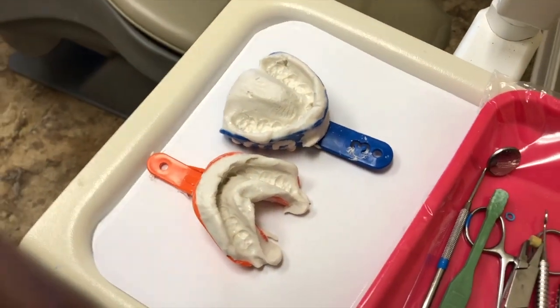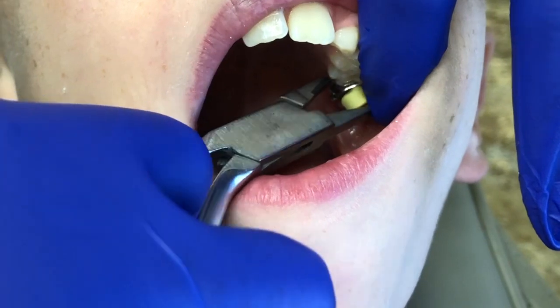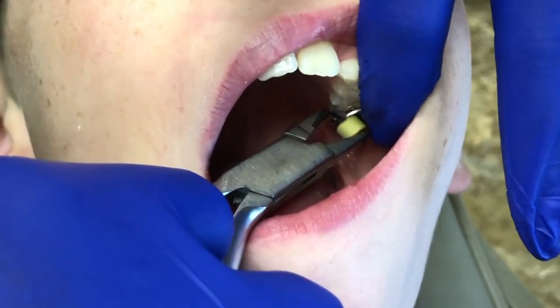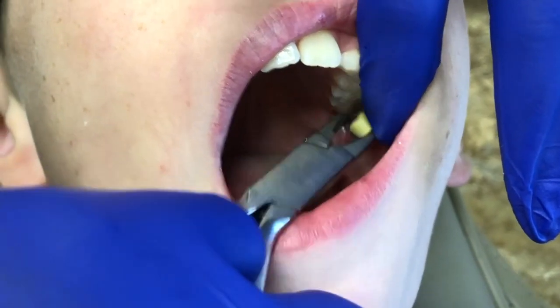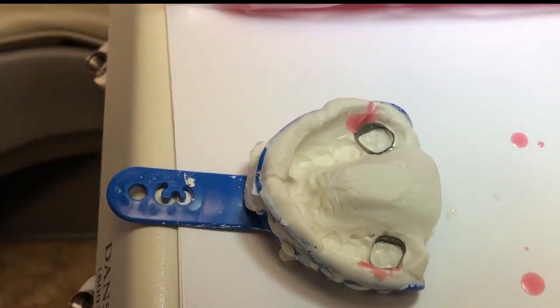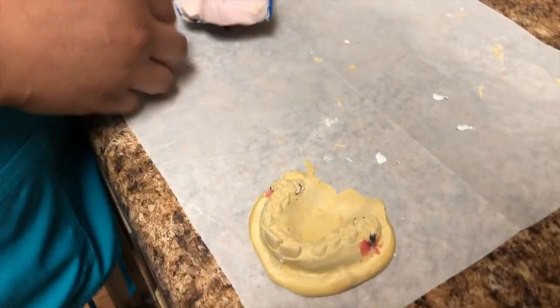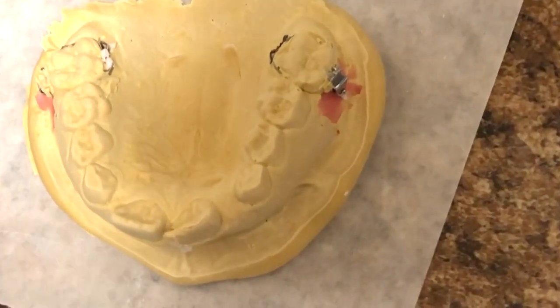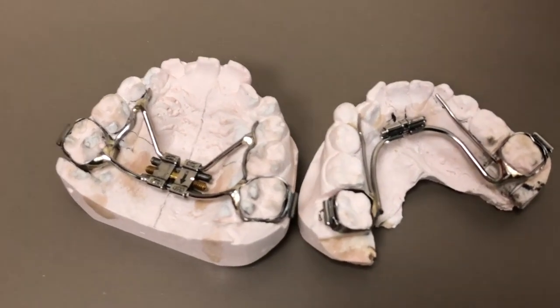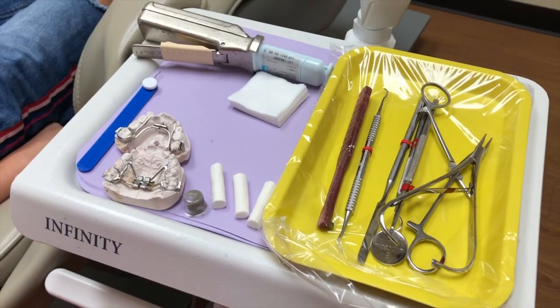These impressions are prepared and sent to the lab for fabrication of the appliance. Once the appliance comes back from the laboratory, we are all set to get ready to deliver the appliance.